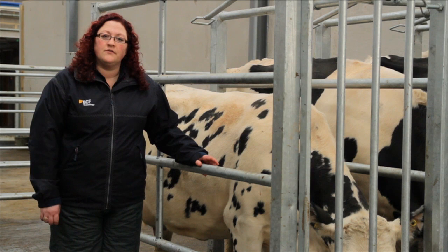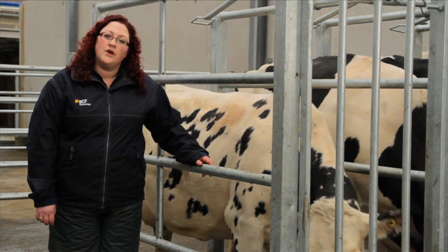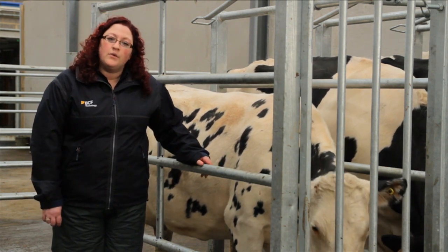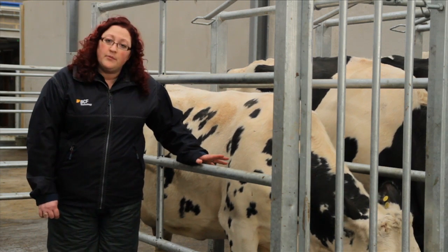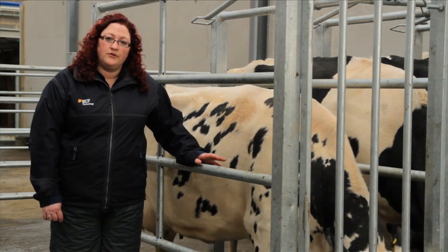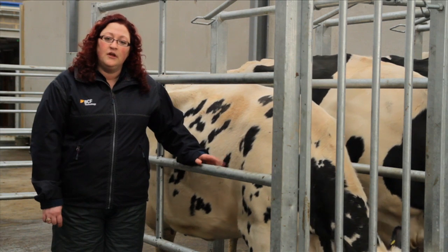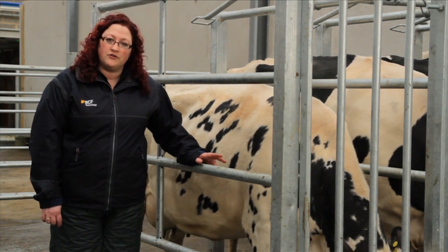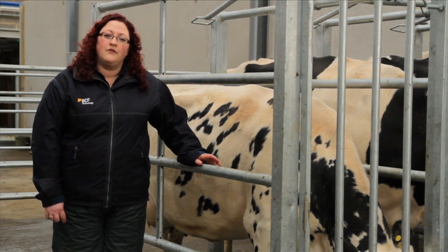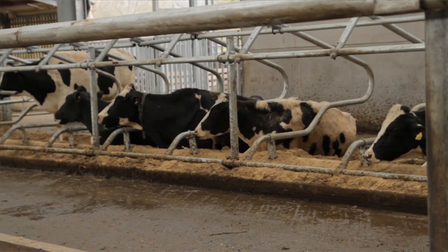Some additional benefits of the use of ultrasound compared to manual palpation or blood tests is that we're able to not only, as we said before, evaluate the pregnancy, but we can also look at the viability of that fetus by visualizing a heartbeat. We can also be able to determine if there's a twin pregnancy, potentially earlier than by manual palpation. We can also look at the ovarian structures, such as the presence of a corpus luteum, or other structures, such as a follicular or luteal cyst. This will enable us to better manage the herd on an entire level.